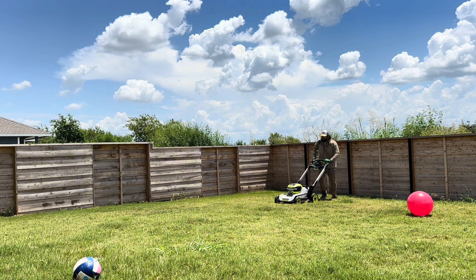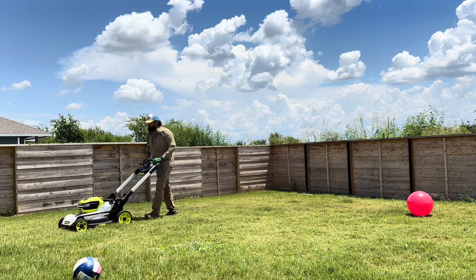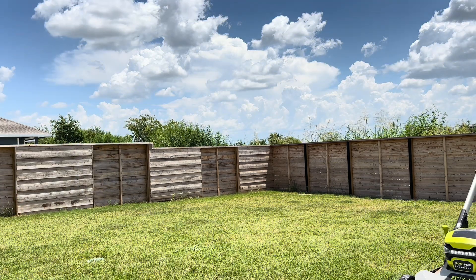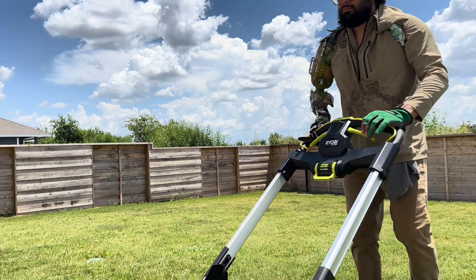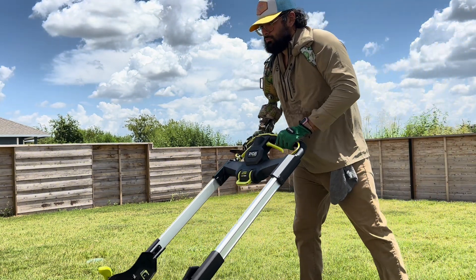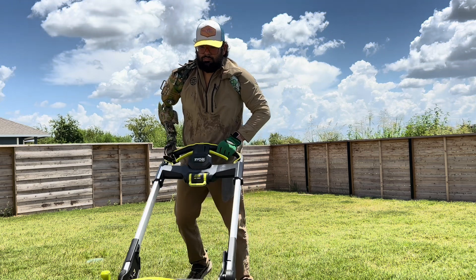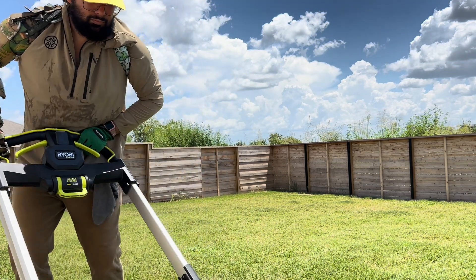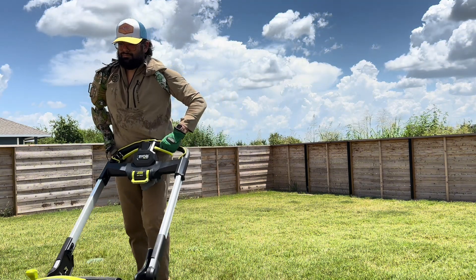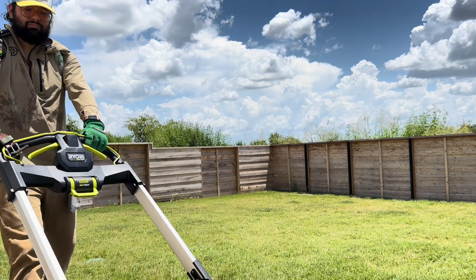I've broken them so many different ways that I already know not only how I break them, but when I visit and talk to other prosthetic teams, they tell me their own patients are advised not to use prosthetics the way I do because you risk breaking them. That's specifically true of bionic hands and elbows — though there are some tougher claws. Anything where motors control the fingers and elbow movement up and down is very vulnerable, especially compared to legs.